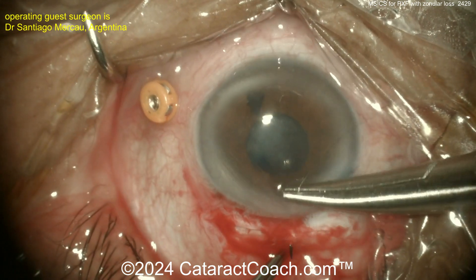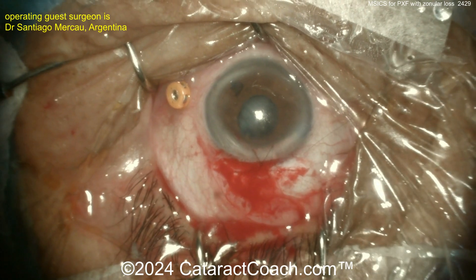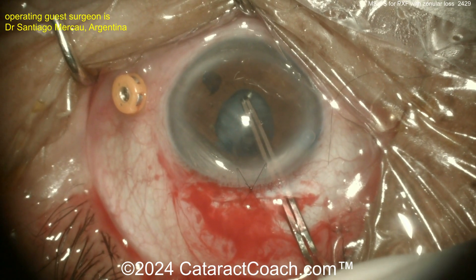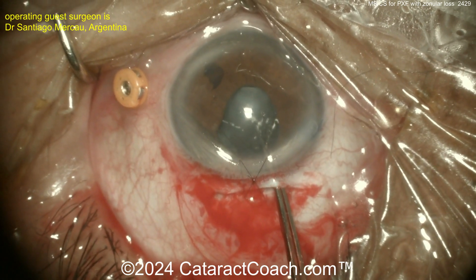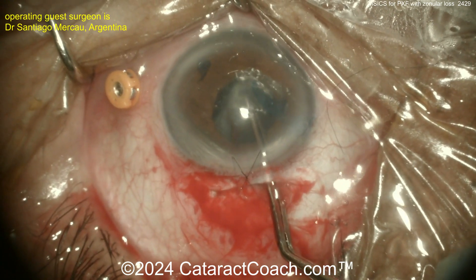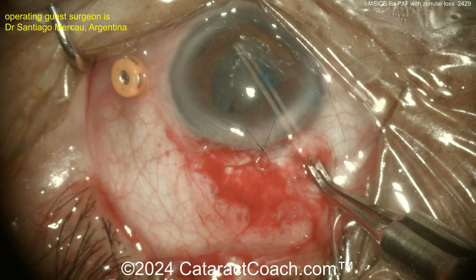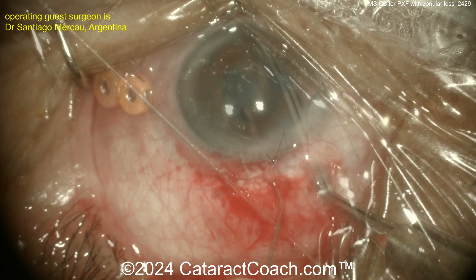I like this idea: suturing up the incision before trying to do any cortex removal. Now look — the entire capsular bag just comes out of the eye. This is how bad the zonulopathy is. The capsular bag, including all the lens cortex, is just pulled right out of the eye with your capsulorhexis forceps. There simply is not enough zonular support.